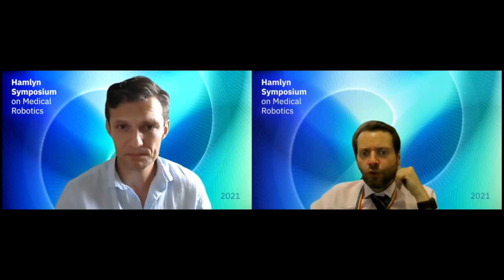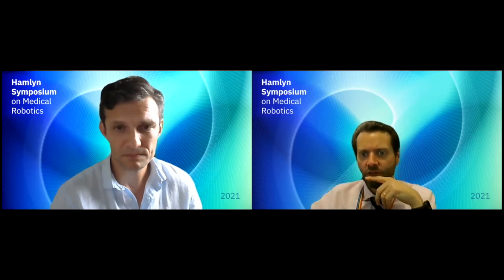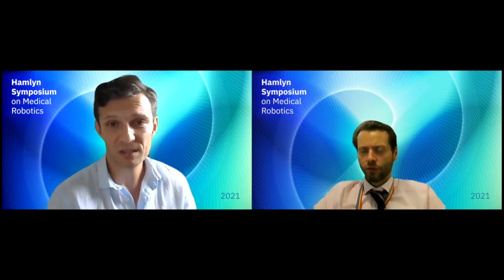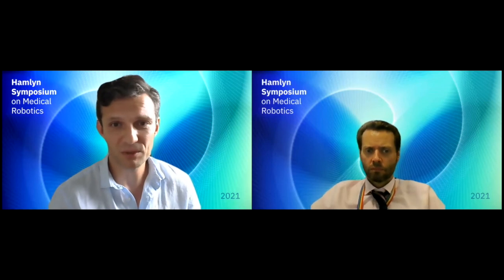Brian asks, you showed that the mosaicing task was significantly improved by including the segmentation maps of various vessels. Do you suppose that tasks such as this will be further improved when using multispectral data or optics? Hopefully. I guess multispectral data, depending on the resolution and various other things, may give additional information, hopefully information below the surface, which would be useful. I think the challenges there are obviously capturing that data in a way that can be used for processing. I think there's still some limitations in terms of how that data can be obtained.